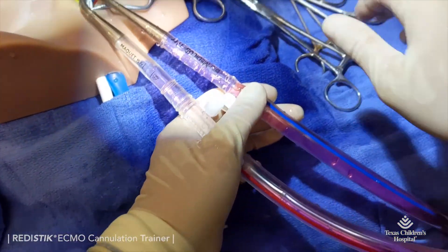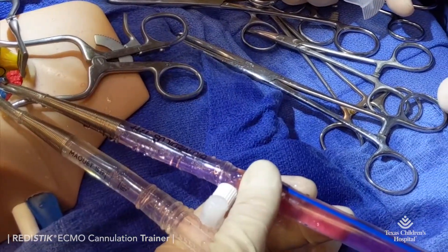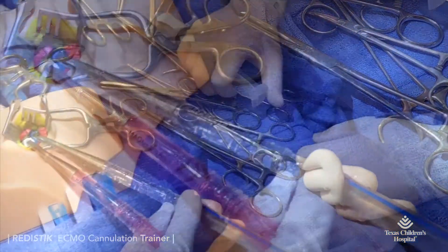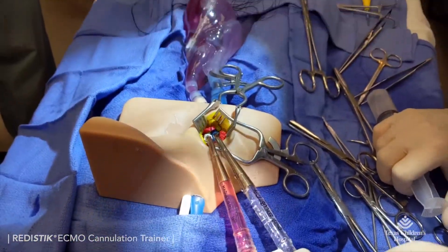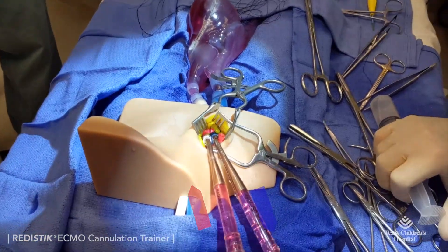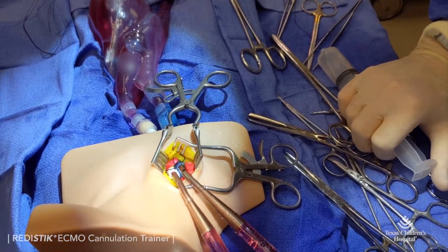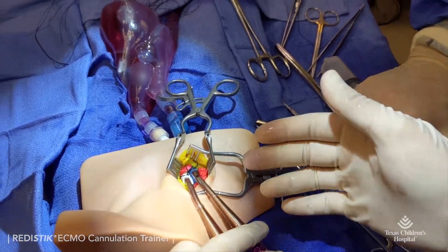We typically use saline to prime the closed-loop system and use stain-resistant color tabs provided in the kit in the ECMO circuit. This allows us to visualize the cannula insertion easily, and when we go on pump, creates a great visual for the team as the closed-loop system changes color, verifying a successful cannulation.